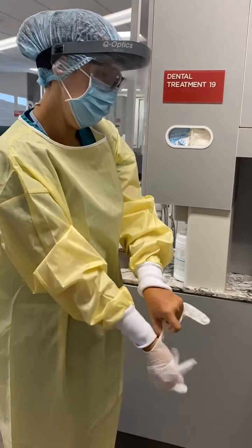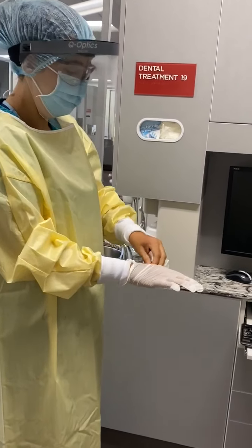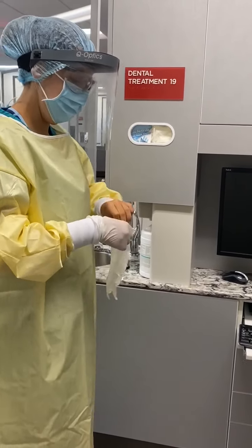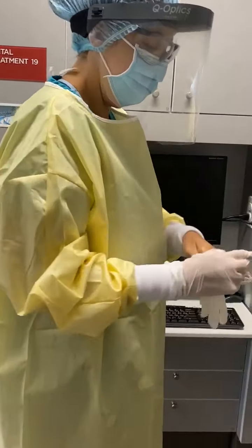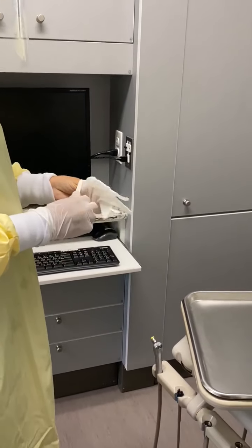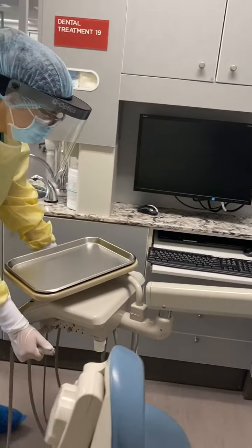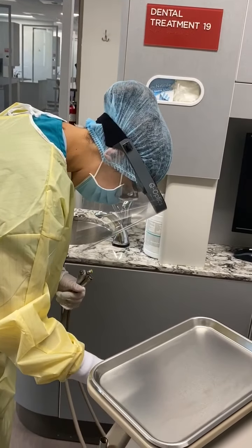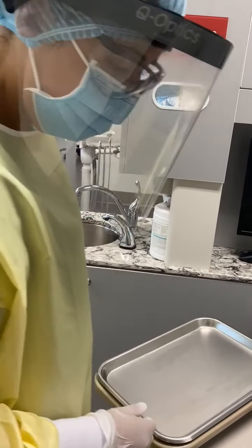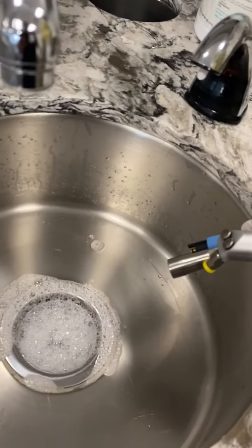Once you have donned a new pair of exam gloves, you will disinfect all areas in the dental treatment area, except for the leather on the dental chair and the stool. But first, we are going to flush our lines for 30 seconds. The full protocol for flushing lines is two minutes.